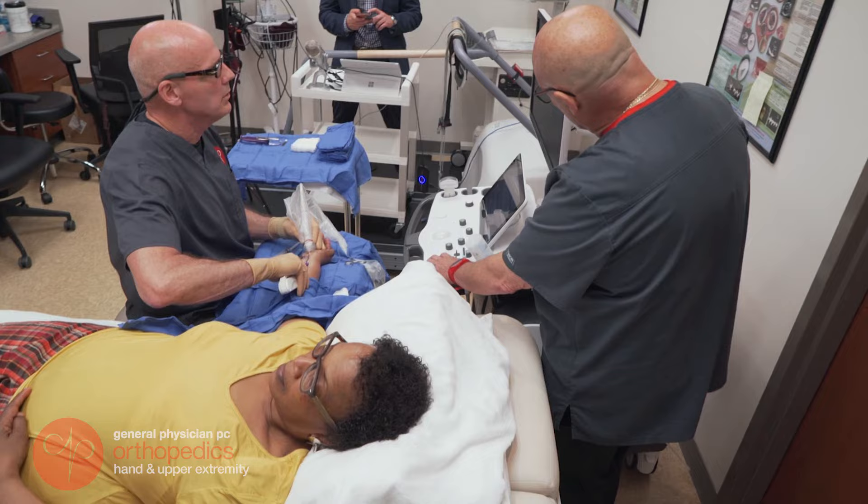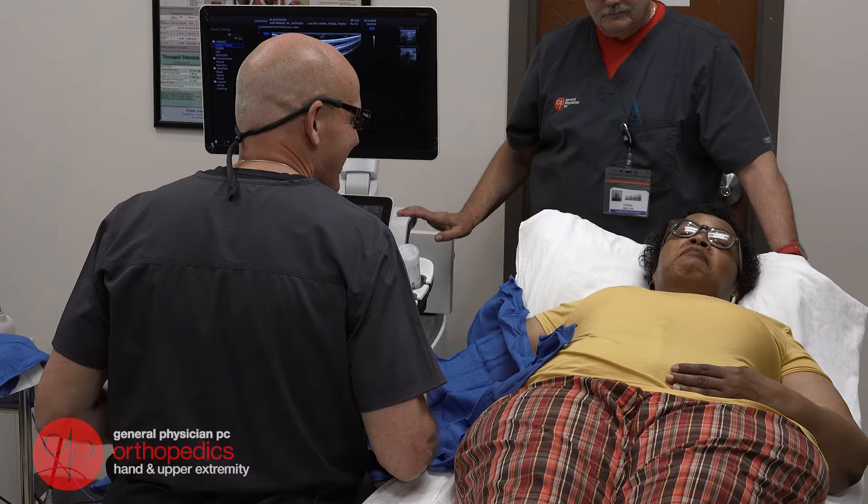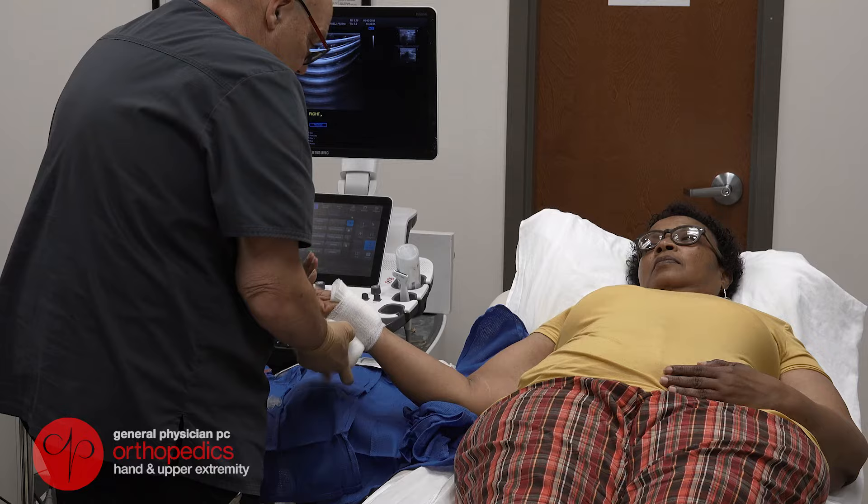Once the ligament is cut, that will increase the space for the nerve and allow blood to flow. And as you can see here, the procedure's done, the patient's comfortable, and everybody's happy. After the procedure is completed, a light sterile dressing will be applied. This can come off the following morning, and the wound can get wet.